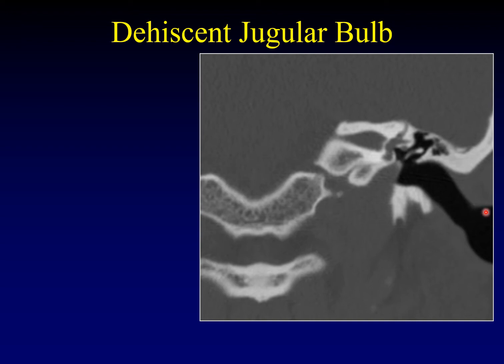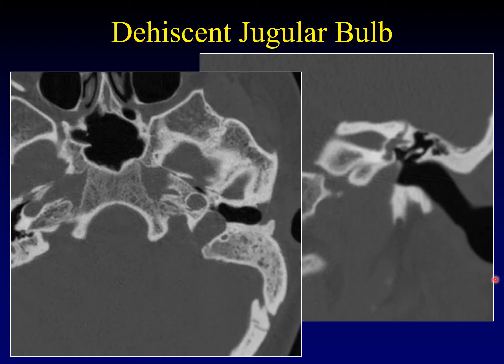There is a normal bony covering of the jugular bulb called the jugular plate. When that bony covering is dehiscent, pulsations can transmit from the jugular bulb into the middle ear and be audible as pulsatile tinnitus. You're looking for a lack of bony covering overlying the jugular bulb — normally you should be able to see the jugular plate as a thin line. On axial images, you can see the jugular bulb with a lack of normal jugular plate separating it from the middle ear cavity.